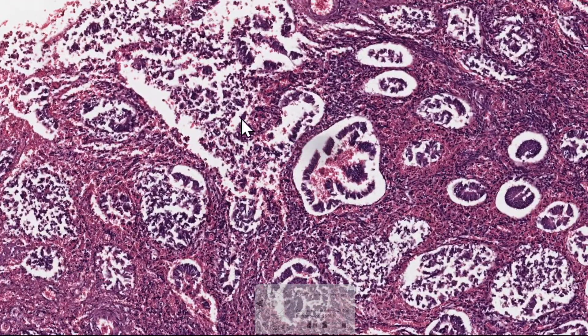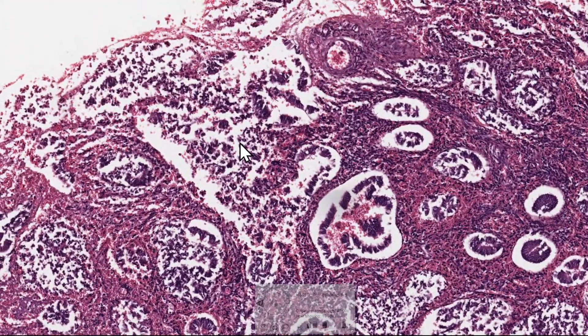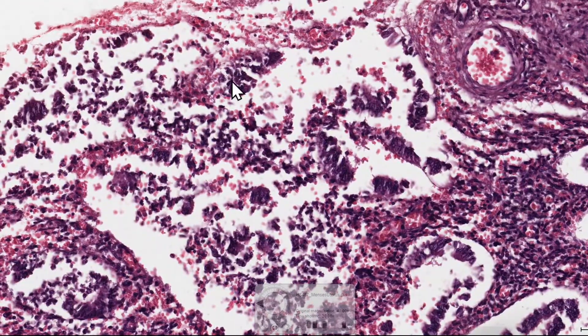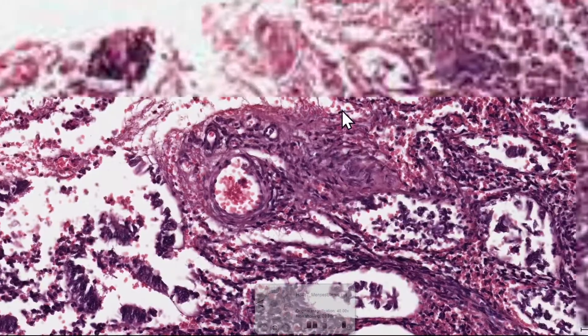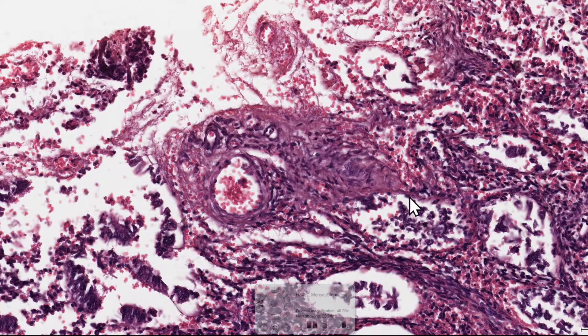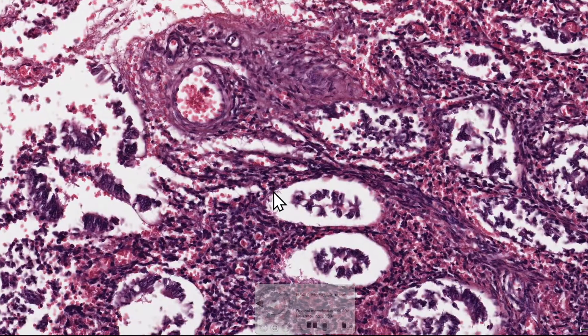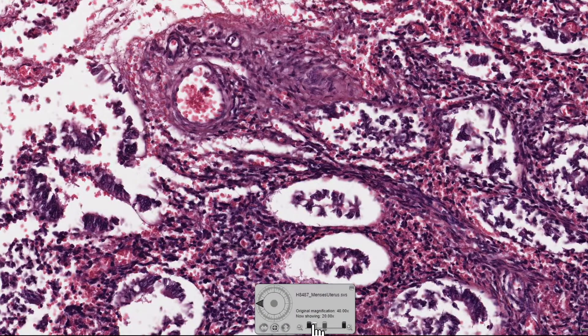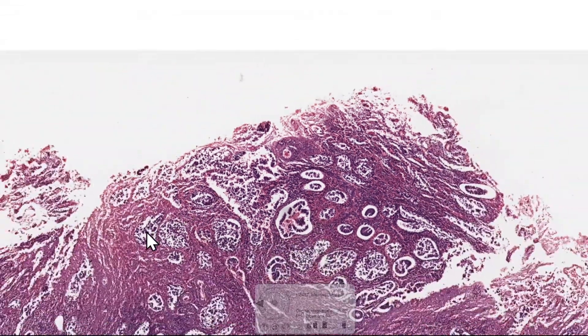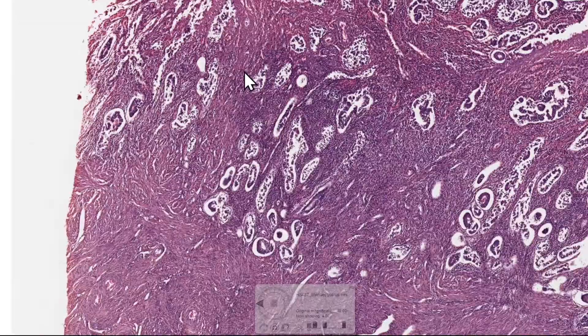We've actually got lots of disruption going on. The cells are dying, and the surface epithelium and its stroma and the glands and the blood vessels here are all being shed during this menses phase.